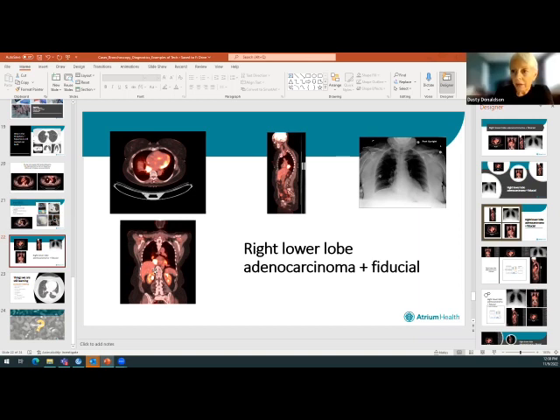Well, and not to mention that the needle biopsy is notoriously inconclusive, right? No, not necessarily. Actually, needle biopsy is probably the most accurate. When you say needle biopsy, it sounds easy to say it's inconclusive. That might have been the case in one instance, but the needle is often the only tool used by some people, or they only do a single pass. You only put it in one or two times. We do multiple passes. We use not just the needle but also a second tool, because sometimes one tool is better than the other.